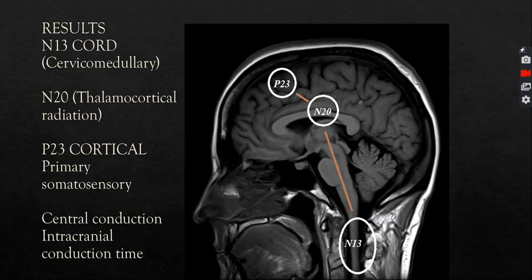What we are expecting to find: when the impulse travels up to the cord inside the cervical medullary part, there will be a wave produced called the N13, which is the first thing we look for. When it travels up to the thalamus, there's another wave produced called the N20, and the last wave called the P23 or P24 or P25 will be produced in the primary somatosensory cortex.